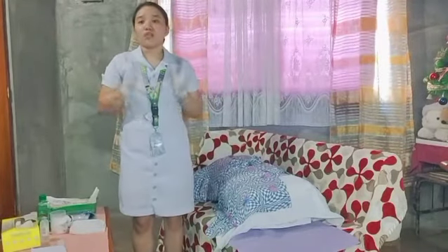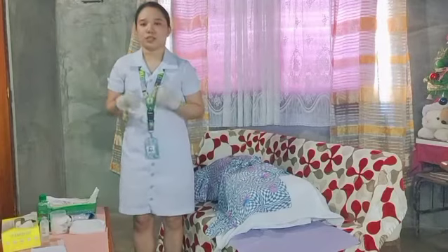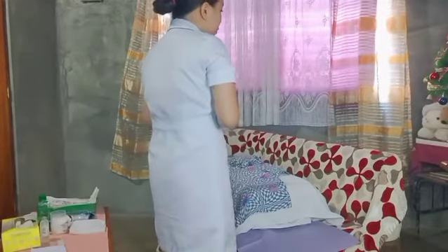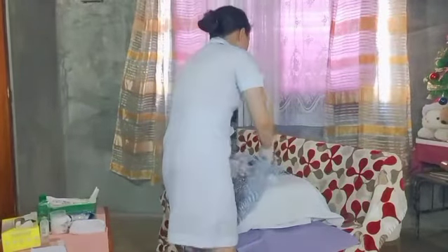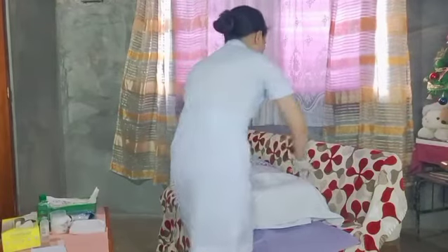So, also cover the patient with sheets and expose only the perineal area for the procedure. So, ma'am, we will remove your pants. And don't worry, because we will only expose the area needed for our procedure. Is that okay? I'm done with your dress, ma'am.